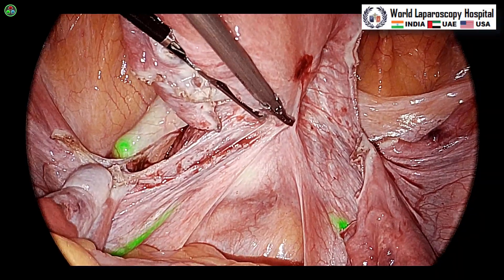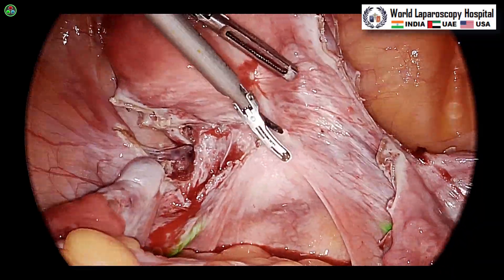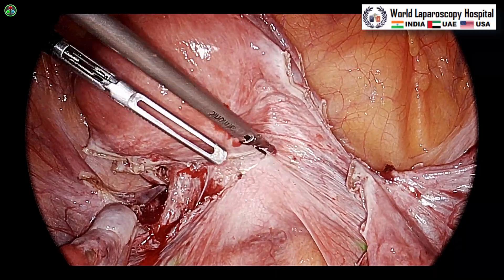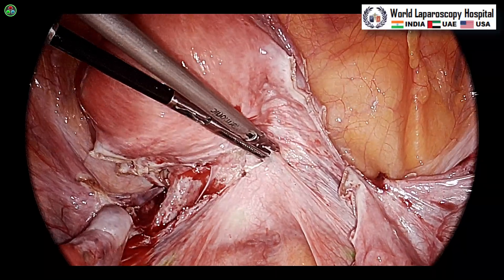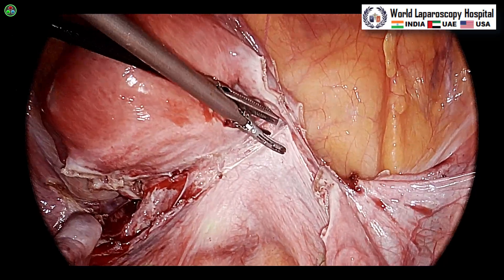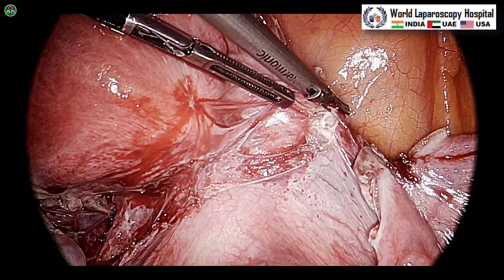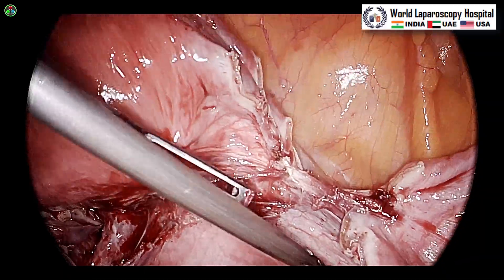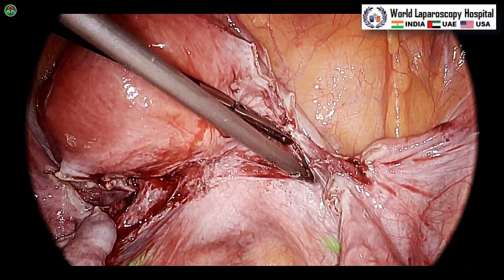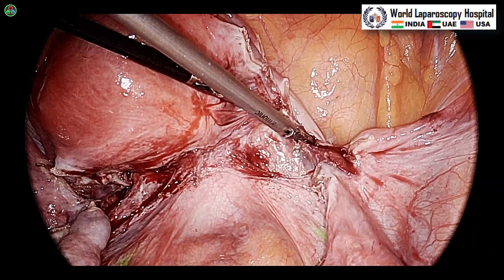On the left side what you are seeing is the Foley's catheter because some of the dye will come into the bladder and stain it. Indocyanine green is very helpful to prevent ureteric injury and you can also use an illuminated ureteric catheter such as the Stryker U-Kit. ICG has its own advantage because in some cases where ureteric catheters cannot be used — as you can see here in ENV mode — the ureter is nicely visible and you can increase or decrease the intensity of the ENV mode.